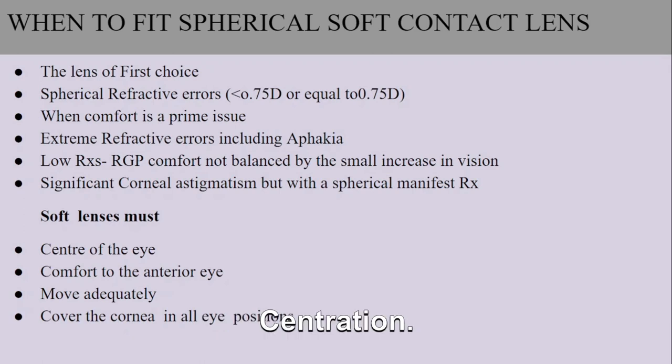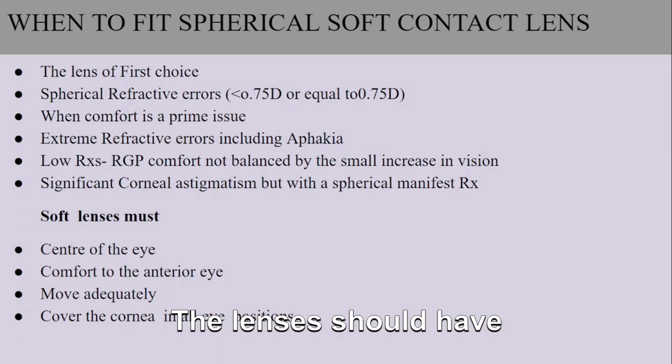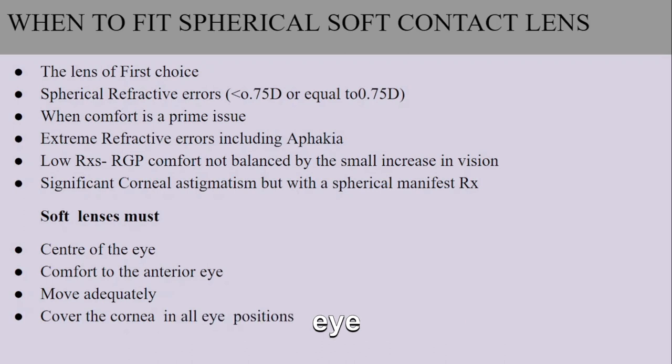Centration. The lens should align and center properly on your eye to provide clear and stable vision. Comfort to the anterior eye. Spherical soft contact lenses should feel comfortable and not cause any discomfort or irritation to the front part of the eye. Adequate movement. The lenses should have enough movement on the eye to ensure proper tear exchange and maintain good ocular health.